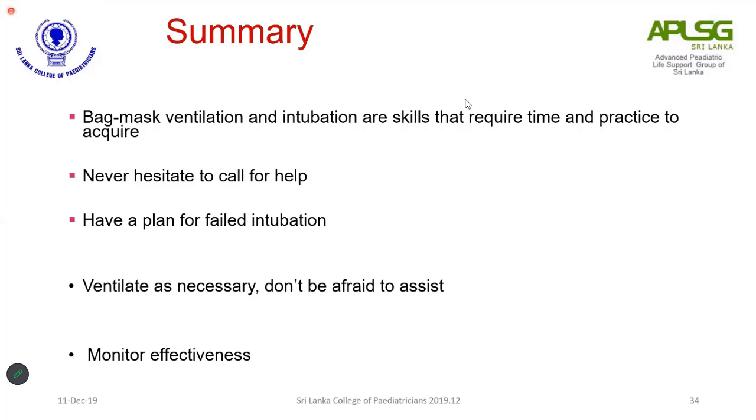And also have a plan for failed intubation before you start intubating. Ventilate as necessary and don't be afraid to assist, maybe even to a junior person. And monitor effectiveness clinically and also by your other equipment to see whether you have effectively managed the airway in the critically ill child.